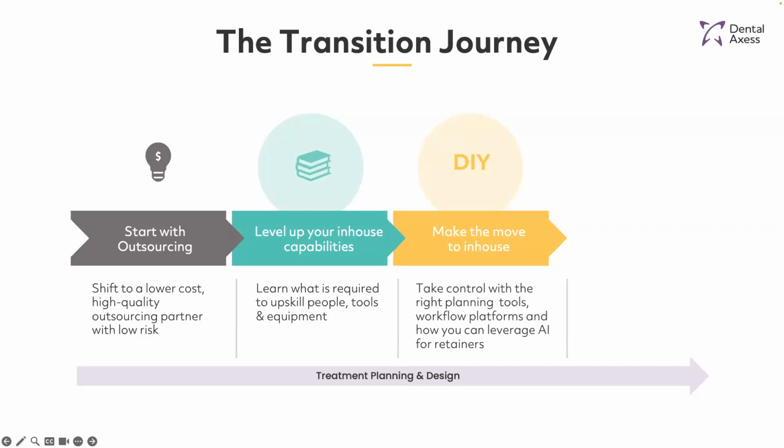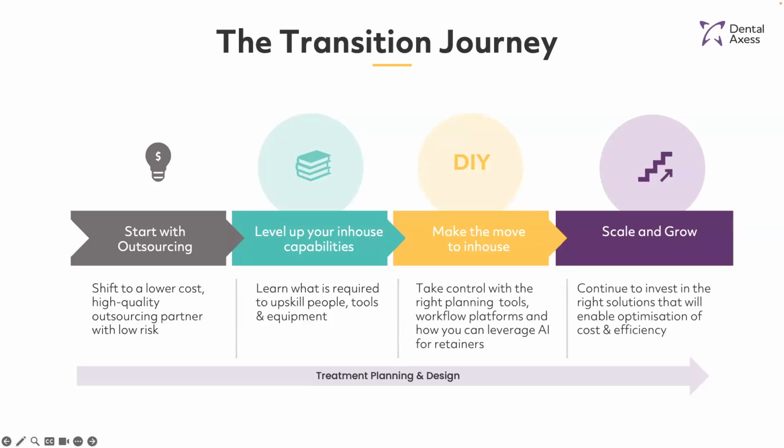And then finally, we'll focus on scaling and optimizing your practice for sustainable growth. From here, we can continuously help you evaluate and refine your workflows to help maximize productivity and help you invest in automation and technology to reduce your operational costs. This approach empowers you to deliver exceptional orthodontic care whilst optimizing efficiency and patient outcomes. We know it works because our clients who start this journey with us have never taken a step back because there's just literally so many benefits to be realized here.